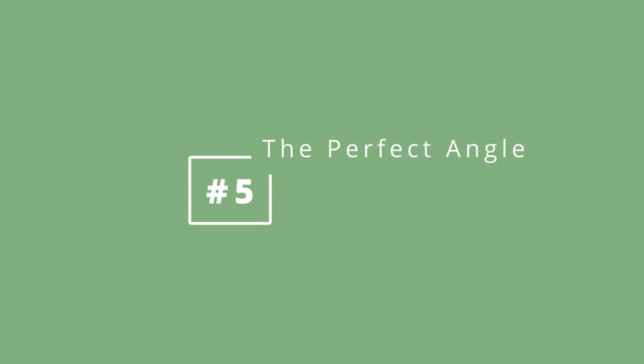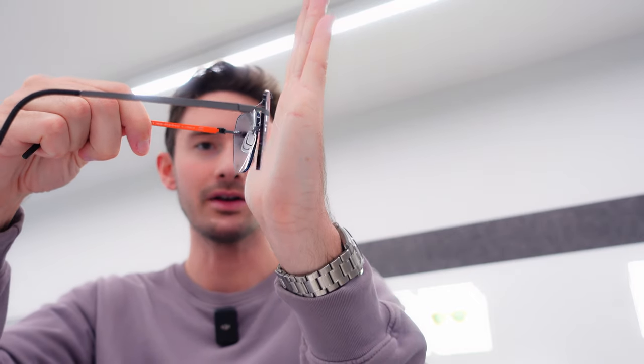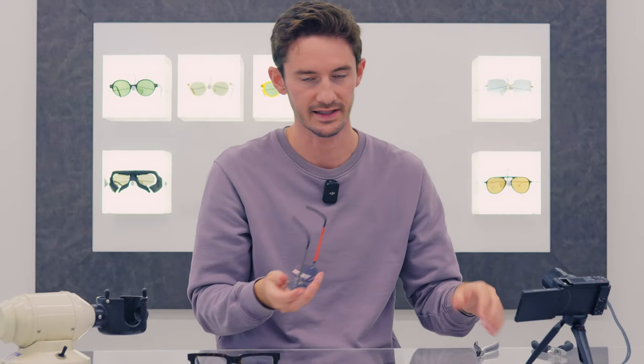For my fifth and final adjustment, we're going to be talking about the frame angle. This is really important, particularly to your vision, because all optical lenses have an ideal angle at which they need to sit relative to the eyes. There are two main angles that need to be adjusted for. One is the bow — the curvature of the frame relative to the face. Second is called the pantoscopic tilt, which is the angle of the lenses in this direction. Adjusting for both of these is quite straightforward with most glasses.